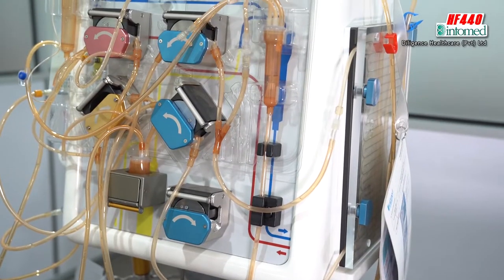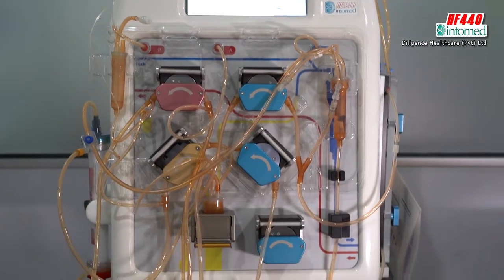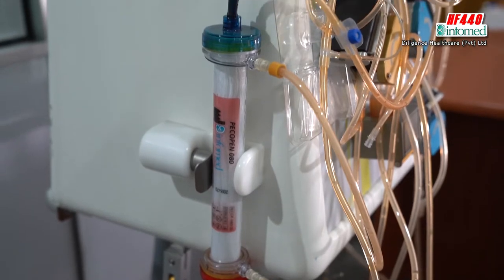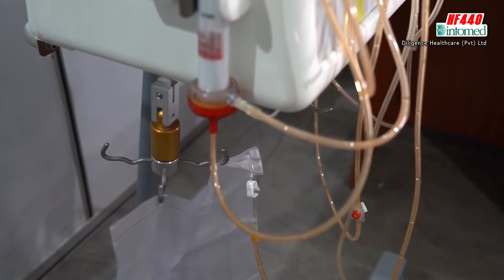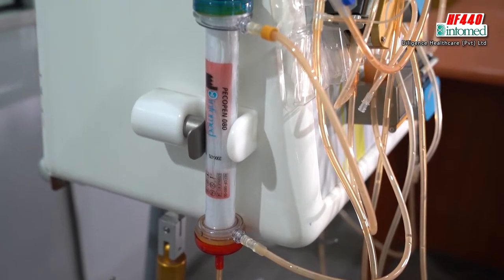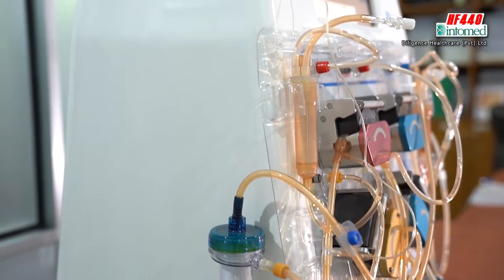Then after that, you have to disconnect the arterial line from the machine and connect to the patient's vascular arterial line and start the blood pump — you have to start it around 30 to 40. When you start the blood pump, the blood automatically comes out from the patient, goes through the tubes and through the dialyzer or filter or the artificial kidney, and returns to the patient.